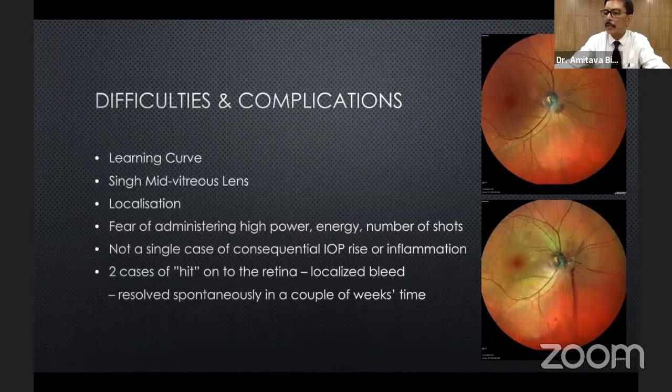The energy per shot is about 5 to 6 millijoules. I start off at 5 millijoules. That is what Dr. Paul Singh taught me to do earlier. Before meeting you, I was using lower energy levels of 3 to 4 millijoules, and I wasn't happy with the results. Ever since I used 5 millijoules to begin with, the results are fantastic.